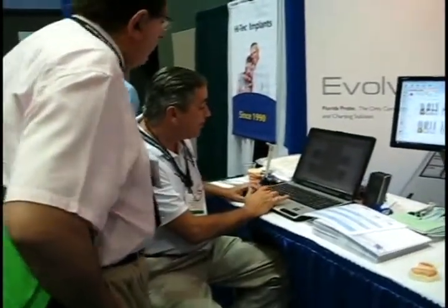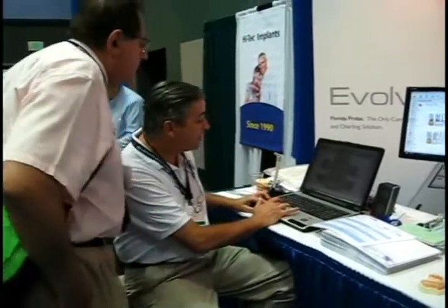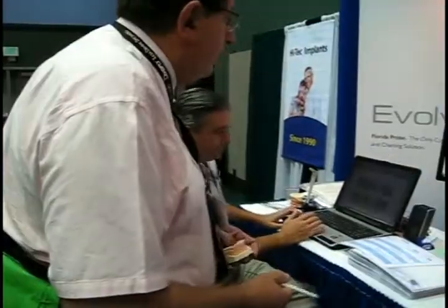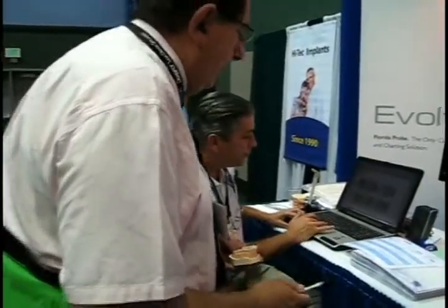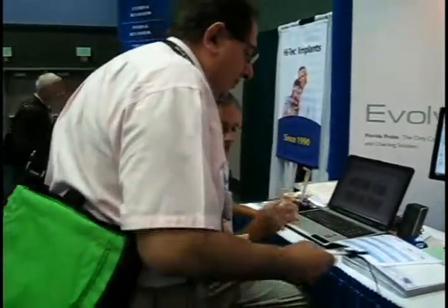So it is a comprehensive exam. And you can do bleeding and probing while you're doing it? Correct. I can turn anything on or off.